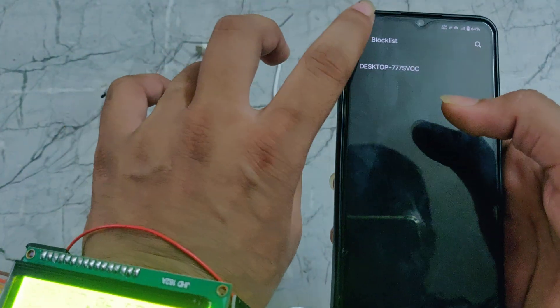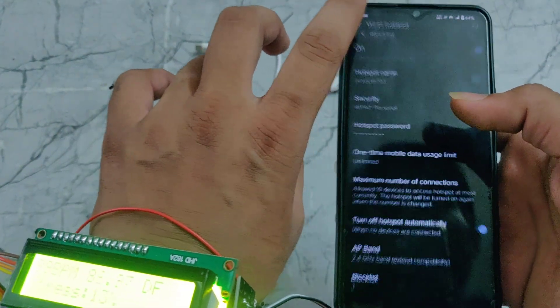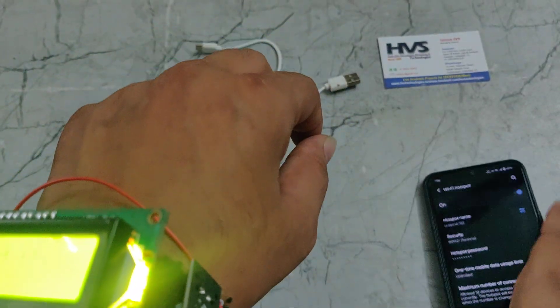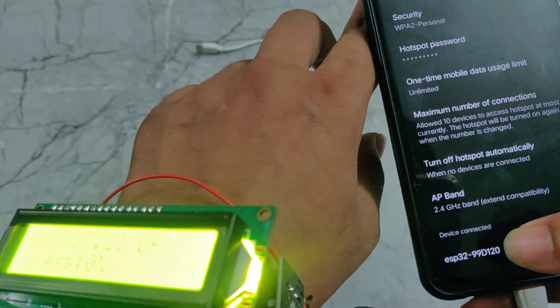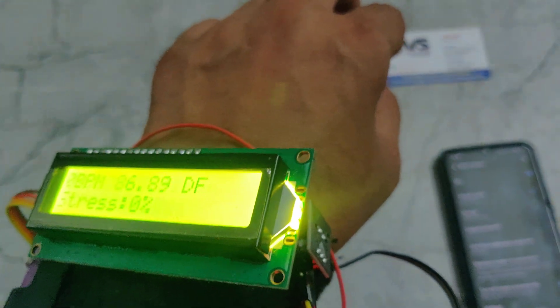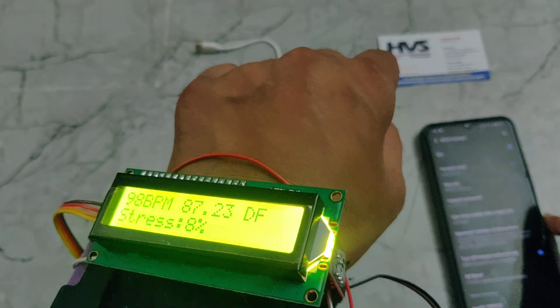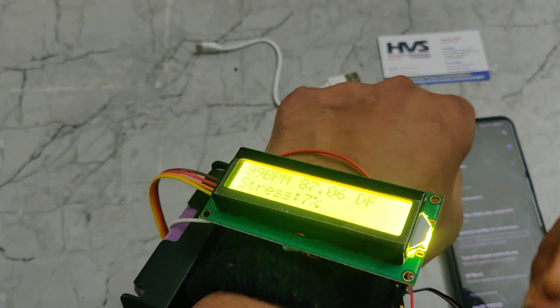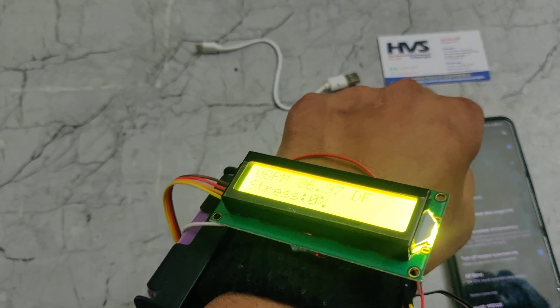One device is connected to our phone. Here we can see the ESP32 is connected. When we share our internet to this device, only then will it be able to send alerts to the email.